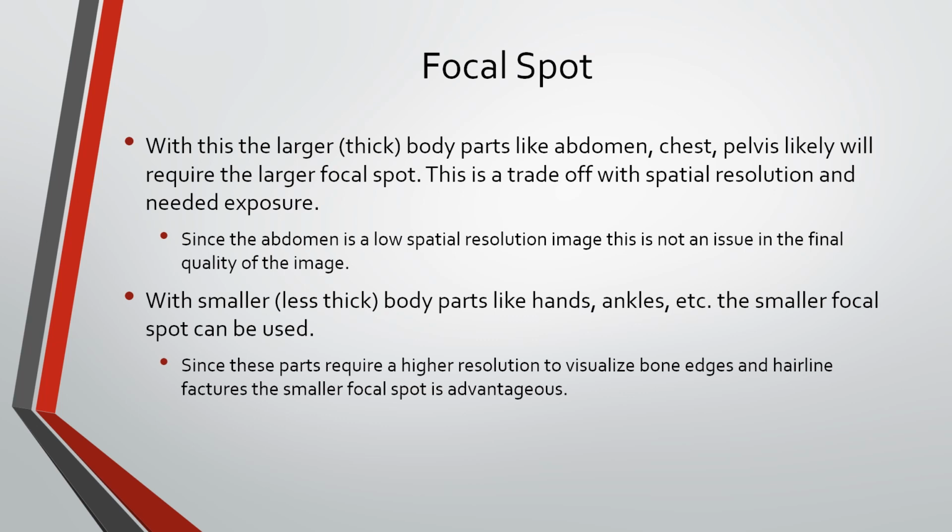So the larger the part, we need to use the larger focal spot typically, and it typically works out okay because the object frequency is lower typically in these parts. And when we need something that's much more sharp, and we get that by the small focal spot, the parts are typically smaller.